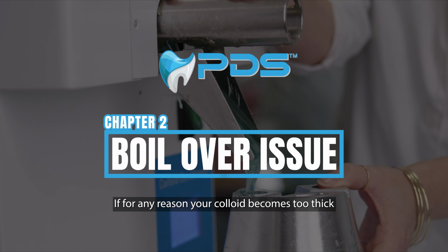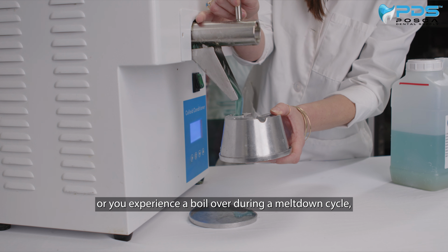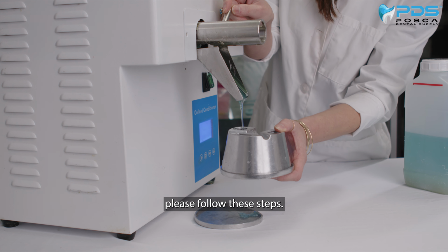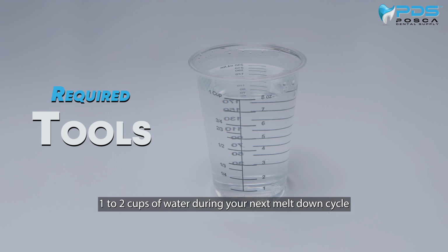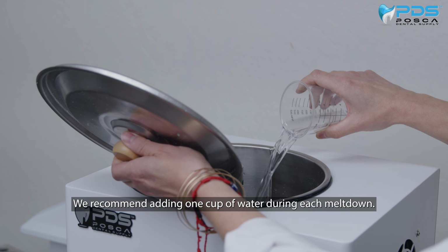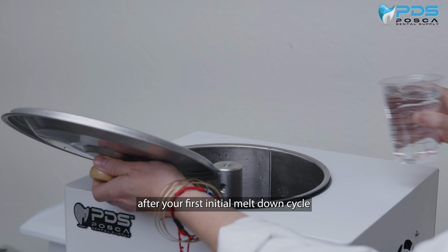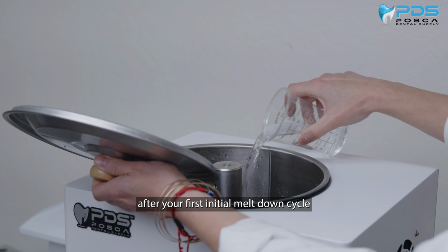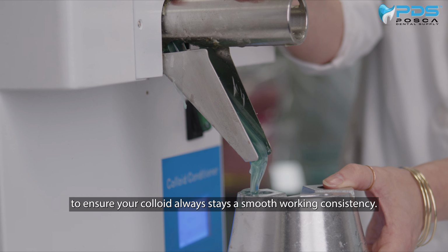If for any reason your colloid becomes too thick or you experience a boil over during a meltdown cycle, please follow these steps. You must add 1 to 2 cups of water during your next meltdown cycle to prevent any future overboils. We recommend adding 1 cup of water during each meltdown regardless of overboil issues after your first initial meltdown cycle to ensure your colloid always stays a smooth working consistency.